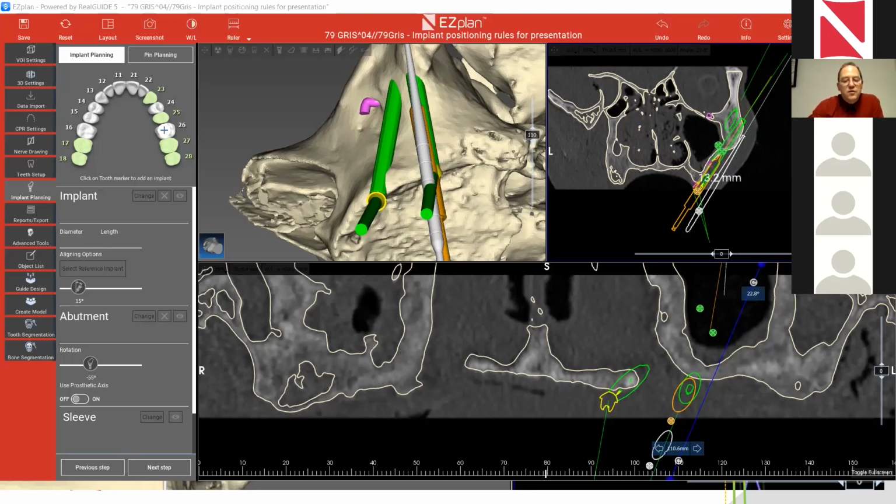Okay, another question. Michael Lee says sometimes the anterior implant is more than 60 millimeters. Could you manufacture longer implants? Well, I agree with you, but it is really, really in unique cases that you need more than 60 millimeters. Today we have in our catalog up to 60.